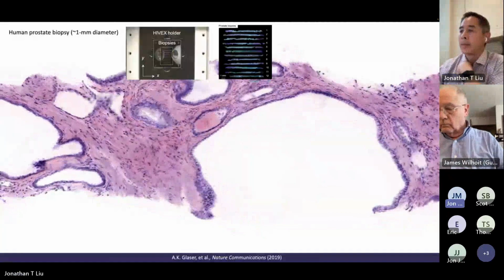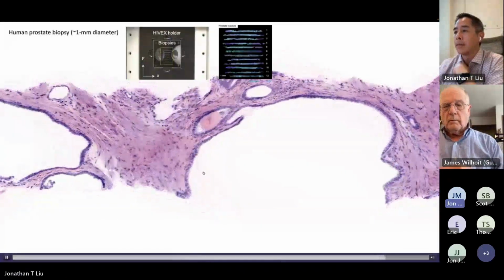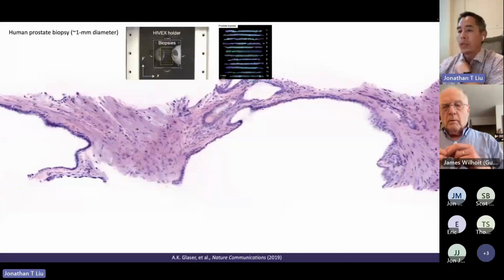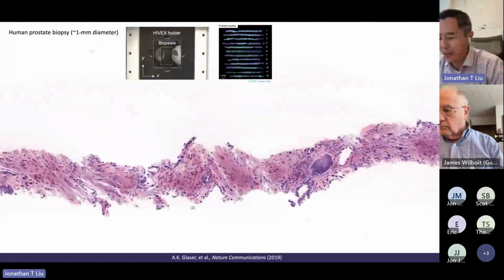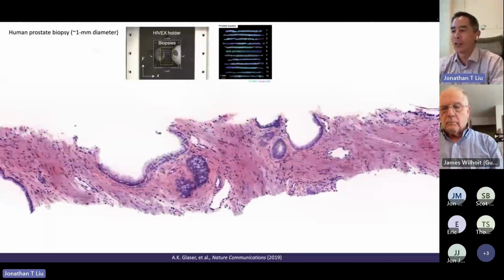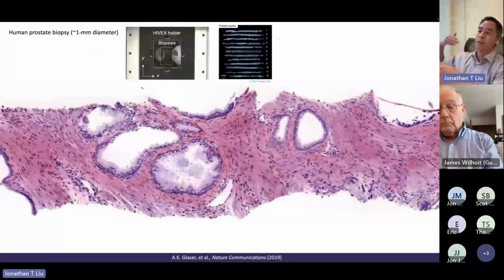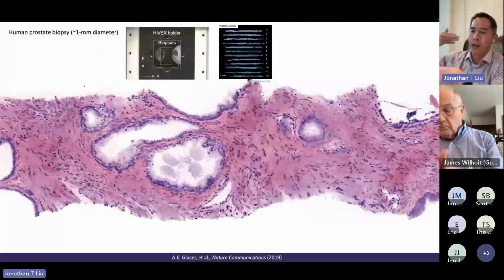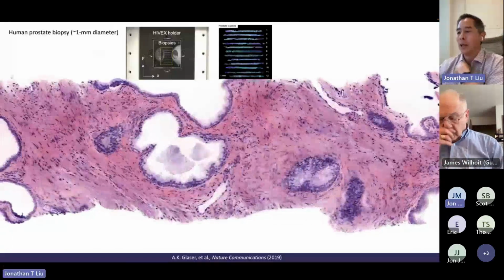John, is that moving in real time? I mean, we're seeing actual movement of the nuclei? Well, this is a depth stack of images. So this is dead tissue. Let me clarify, this is fixed tissue. So nothing's living in this tissue. It's completely stationary. But the reason why it looks like it's moving is because we're slicing through it from one end to the other. I'm just showing a depth stack of images. I get it. Thank you.